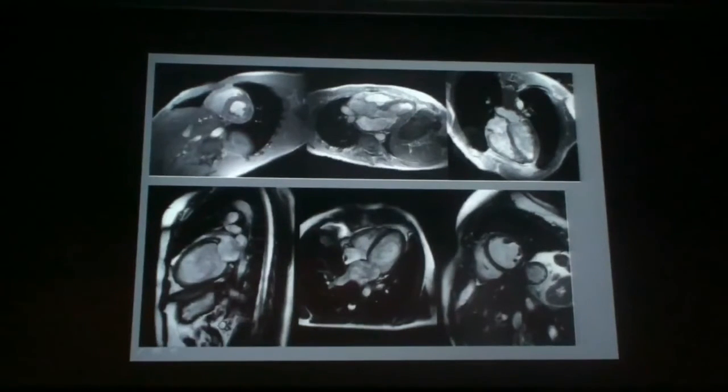And over there on top, you can see the classical FSPGR sequence that gives you an okay contrast between the moving spins and the myocardial wall, compared to a much higher contrast between your blood and the wall of the myocardium using SSFP sequences.